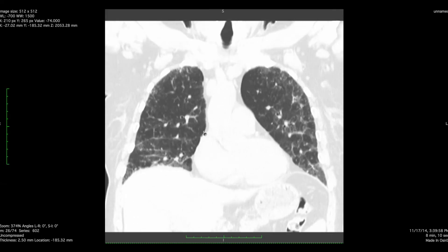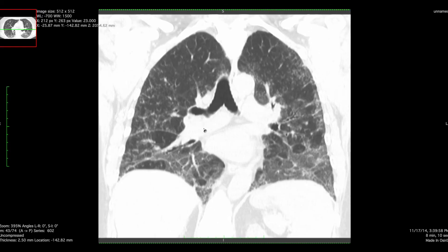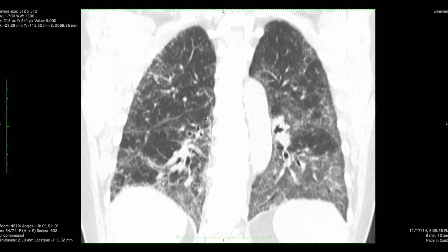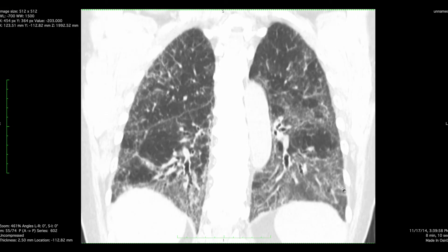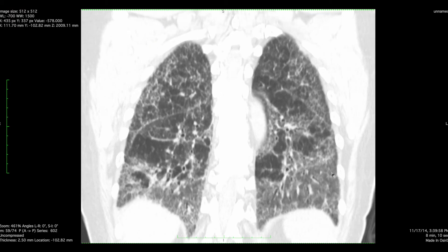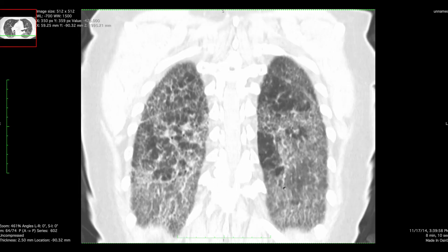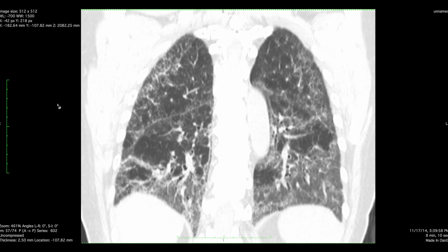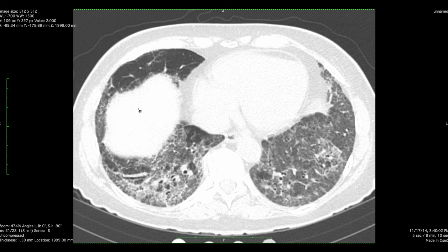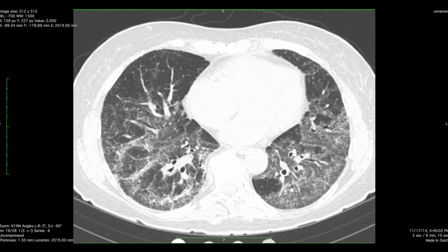Oftentimes the subpleural sparing, if it's there — and you can get a case of NSIP where you don't have subpleural sparing — but if you do, sometimes you really have to squint to see it and it can be quite difficult. In these situations, I often ask my colleagues for their opinion as well. Unfortunately, these cases aren't all textbook and you have to use a little imagination and understanding of how these cases evolve to figure out what the diagnosis ultimately is.